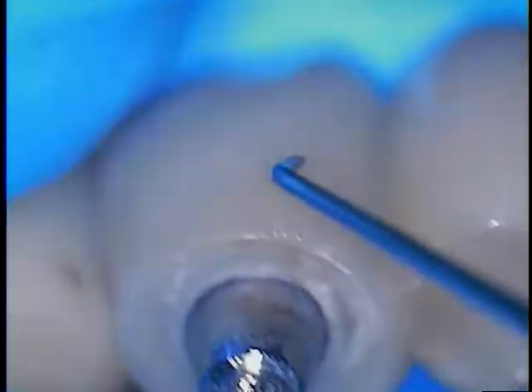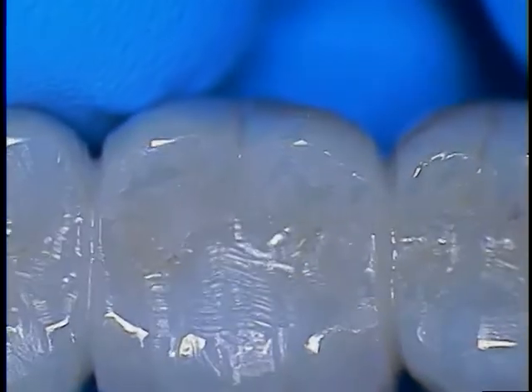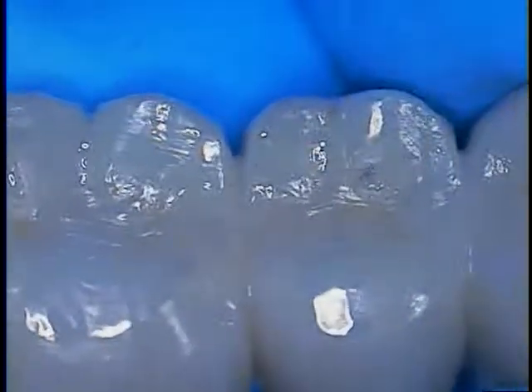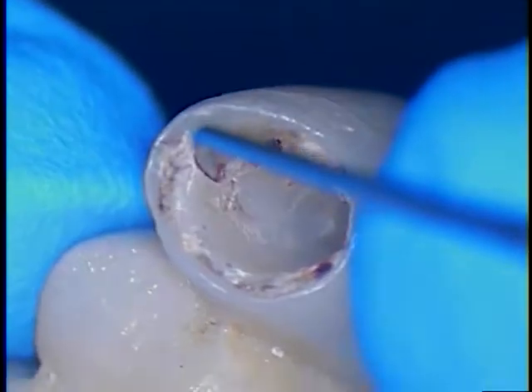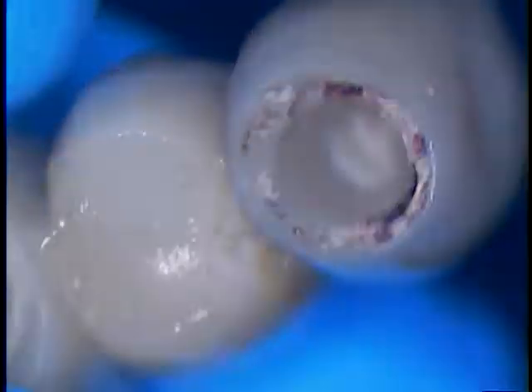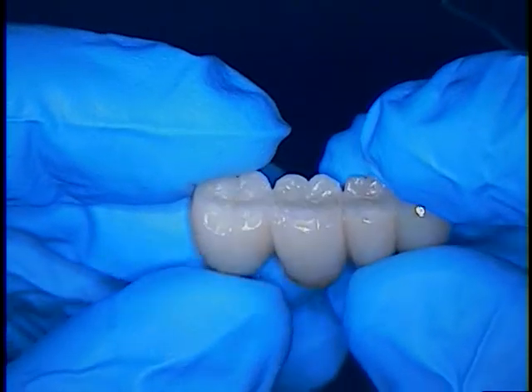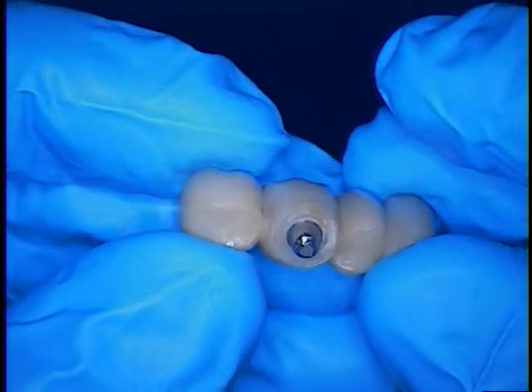Looking at the design, it was cementable. Is this a custom abutment or not? Can we salvage this bridge? There's been a lot of adjusting to the zirconia bridge — you can see the serrations on the occlusal surfaces, so there must have been an attempt to adjust the patient's bite. There's also cement still inside the anterior abutment. This is a four-tooth cantilever bridge off the distal end of number 30. We don't know the exact cause.